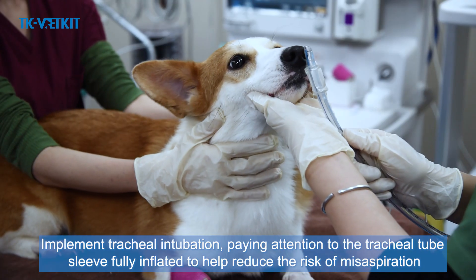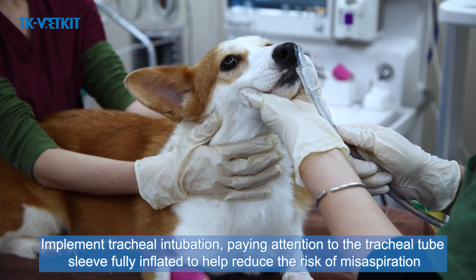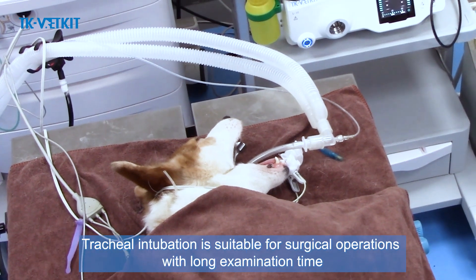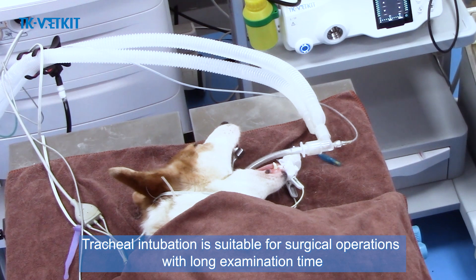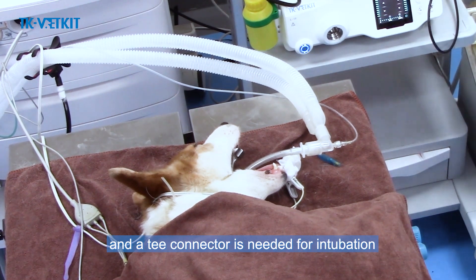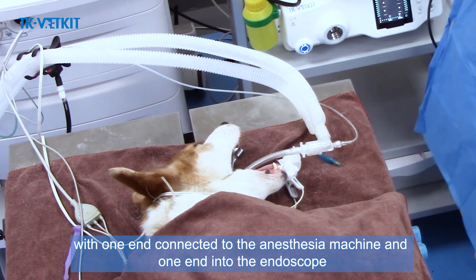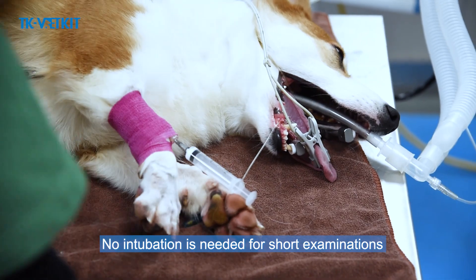Implement tracheal intubation, ensuring the tracheal tube cuff is fully inflated to reduce the risk of misaspiration. Tracheal intubation is suitable for longer examination operations, requiring a T-connector with one end connected to the anesthesia machine and one end for the endoscope. No intubation is needed for short examinations.